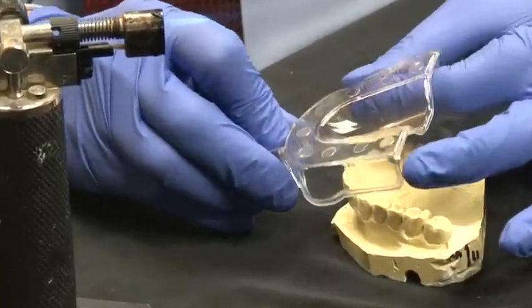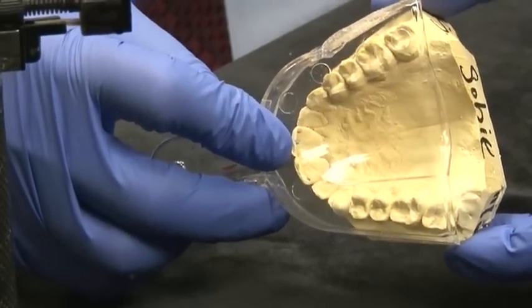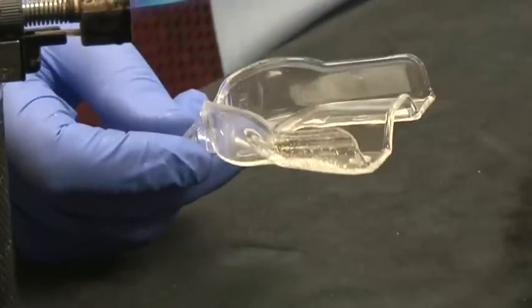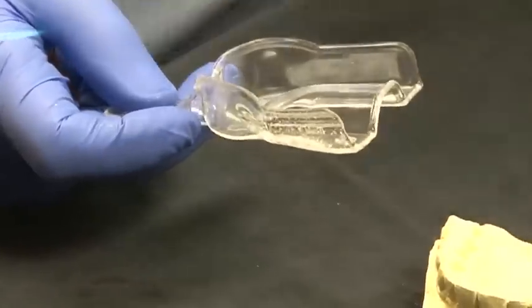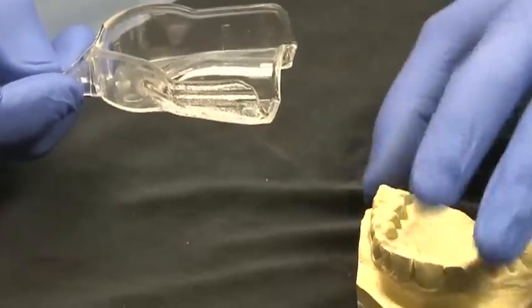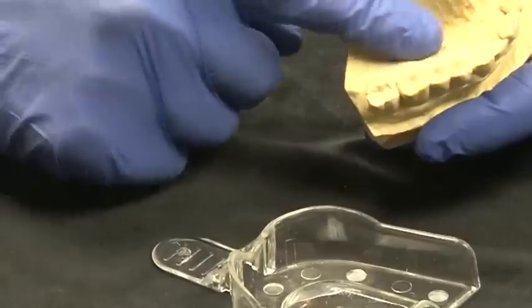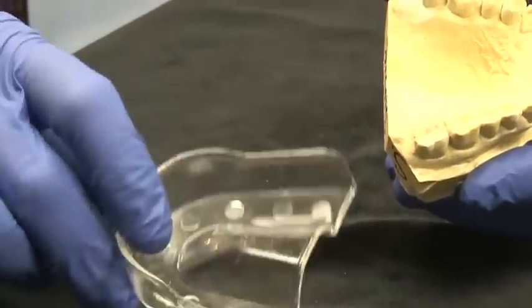Now we check it again to see if it's doing what we want, and we were able to move that out just enough to make it work really nicely. In addition to that, we can go ahead and customize the palatal area. What's really helpful is if you take a little Vaseline and wipe it into this area, then your wax won't stick to the wax that we place onto here.